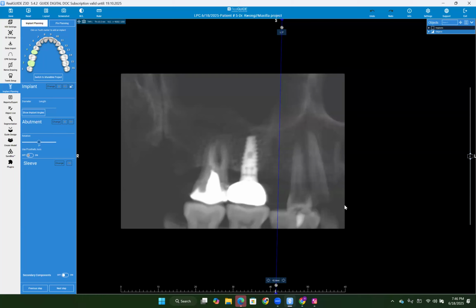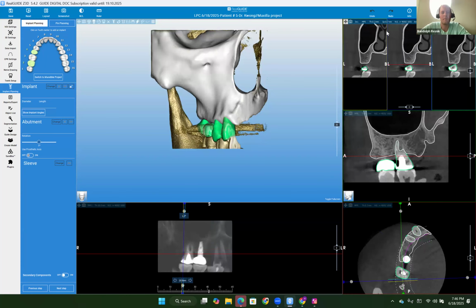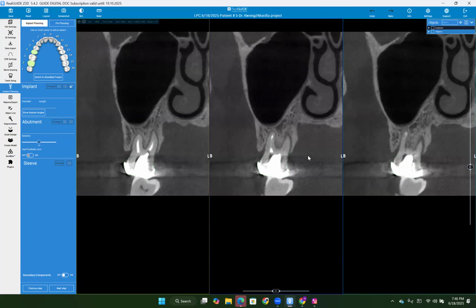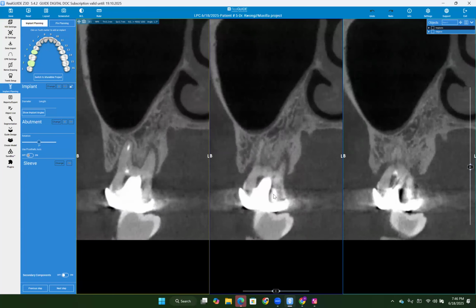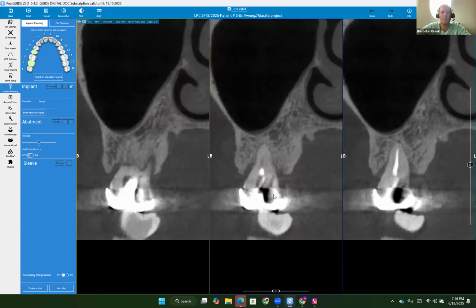The implant on number 3 is because she fractured her tooth 3 years ago, so I placed that implant as well. And then now, October last year, she fractured the number 4. So the number 2 is showing a fracture line on her tooth. She's debating whether she would do an implant or not, but she's not so fond of doing sinus augmentation, as far as I know.